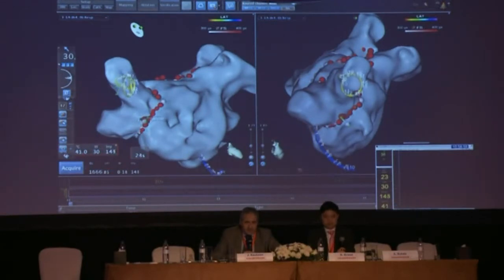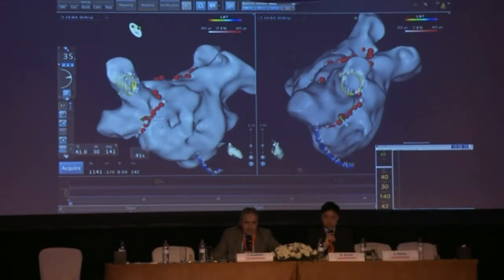Well, it's this bit here, Joseph, isn't it? The bit where we just isolated. That junction between the right atrium and the left atrium. If you go wide of that, you can get continued conduction. If you just go in a little bit, as you say, you can often find that you can isolate in exactly the way we've just done now.